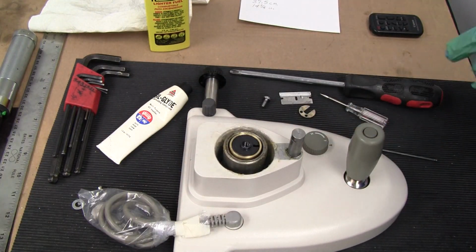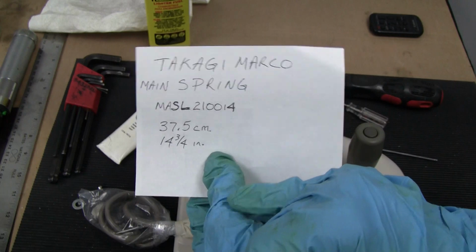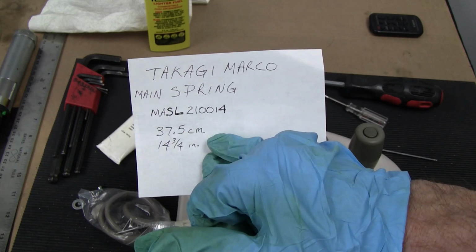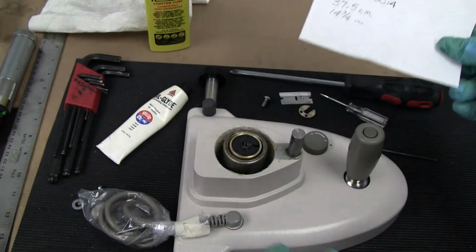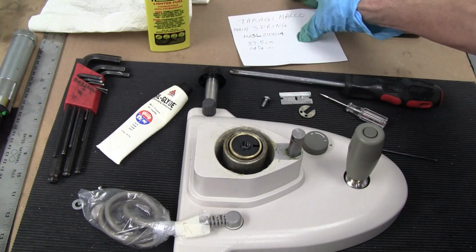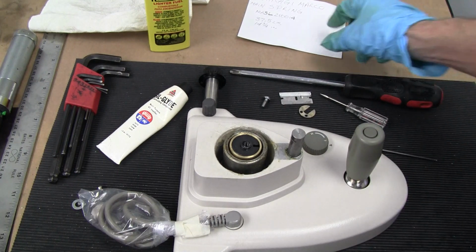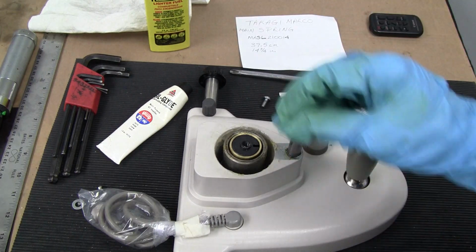Okay, once you've removed your spring, if you wanted to measure your spring to see how bad it is, a new spring is around 37.5 centimeters or 14 3/4 inches, and you can measure yours to see how much it's off. It's a pretty strong spring, but if it's an old slit lamp and a lot of wear on it, it could collapse a few inches. And 2 inches does make a lot of difference on a spring.